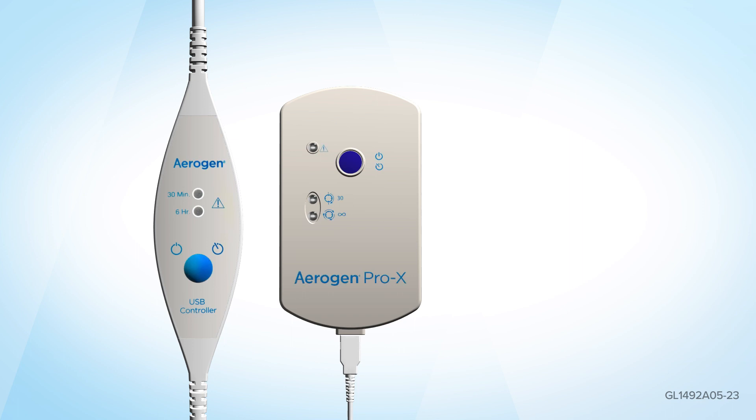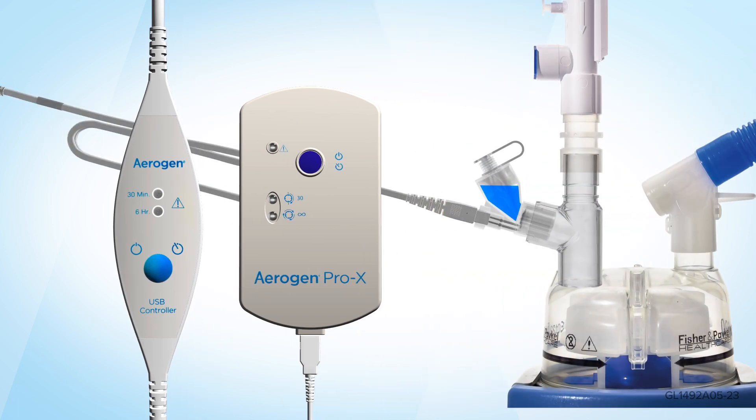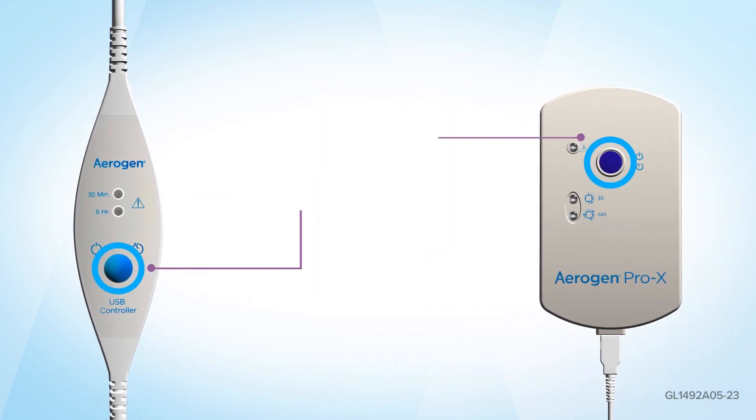Connect either the Aerogen Pro-X controller or Aerogen USB controller cable to the Aerogen Solo. Press the on-off button on either the Aerogen Pro-X controller or Aerogen USB controller for 1 second to select the 30-minute mode.